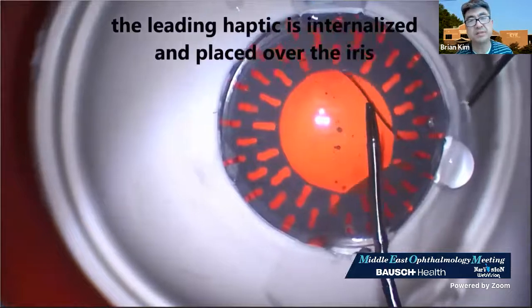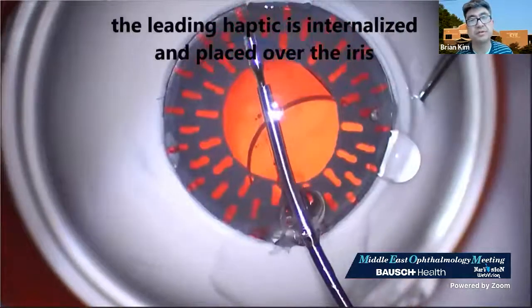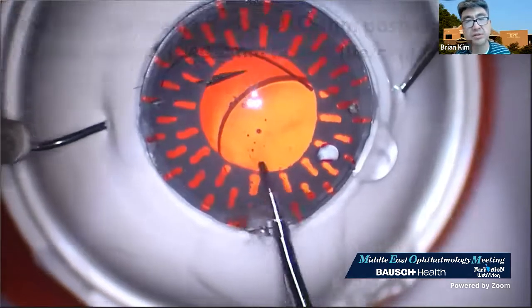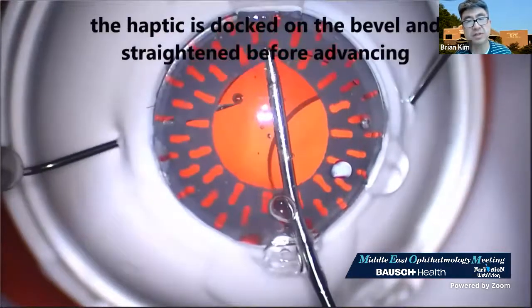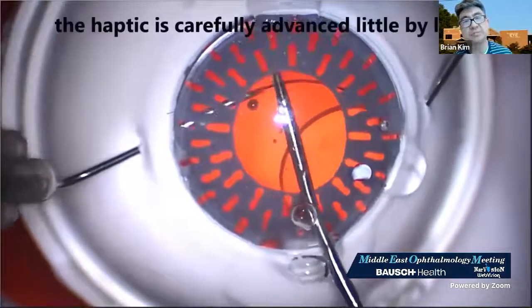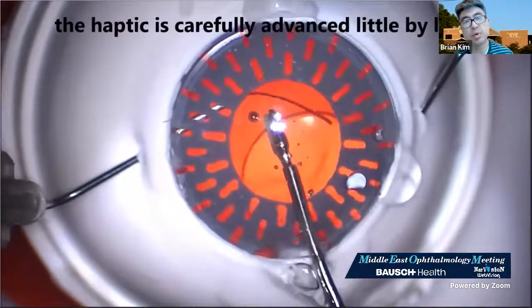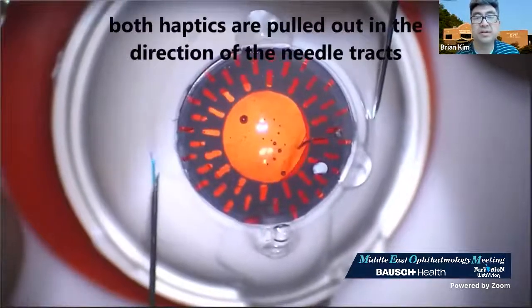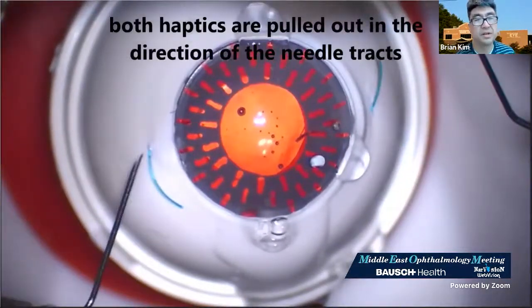And then leading haptic is internalized over the iris. The left side needle is placed 2.5 millimeters posterior to the limbus, tunneled 2 millimeters. The haptic is docked on the bevel, straightened and flattened. You can see even though I was grasping the haptic somewhat more proximal, I was able to flatten it out and thread the haptic into the needle.